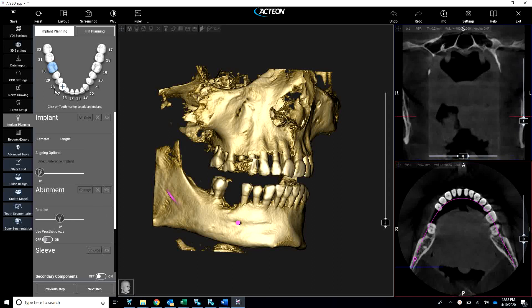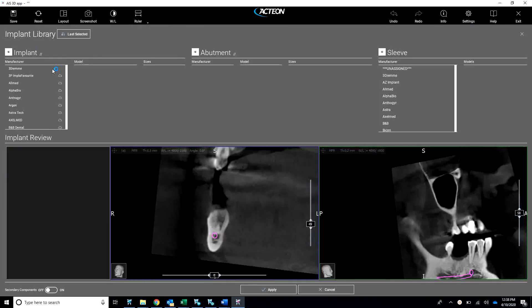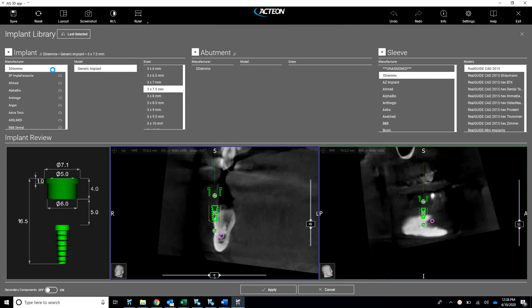Then here we're picking our implant — tooth number 30. We'll bring you into our implant library. We have a nice robust implant library here. If one of them is not on here that you use, we can simply download it so it's available to you.